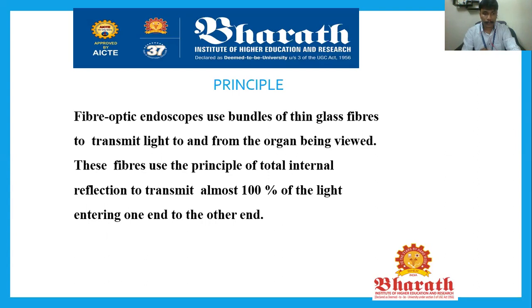These fibers use the principle of total internal reflection to transmit almost 100% of the light entering from one end to the other end. The image captured by the camera is completely extracted using this fiber optics application in the endoscope, and the captured data is sent to the monitor so that the doctor can view the internal organ structure. This is the working principle of the endoscope.